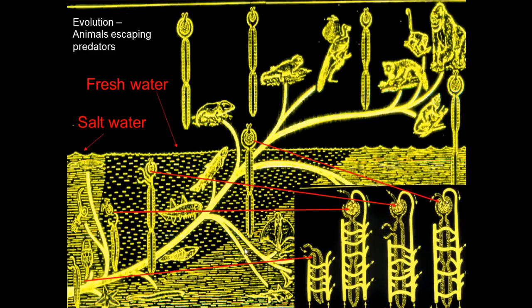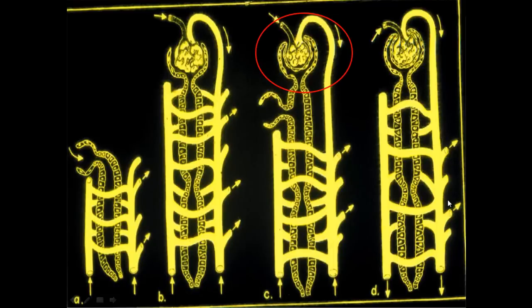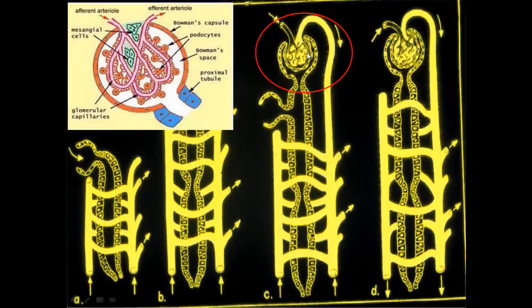So as you see, glomerulus was associated early on with the opening of this tube, and then later it was embedded in the wall of the tube as what we have today. And so here we can see where the blood vessel was embedded in a wall. So these cells here are the podocytes. These are the parietal cells, and through there. And so the podocytes are really part of the original wall.